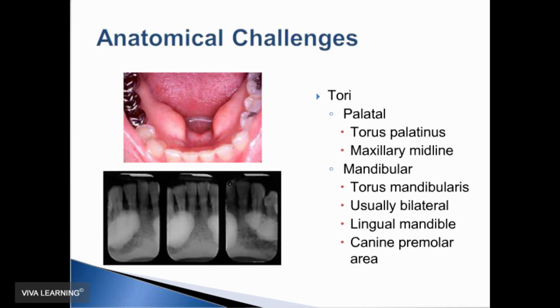Here you can see on these images that the clinician actually has been quite successful, and you can still make out the outline and the periodontal ligament space on the teeth.